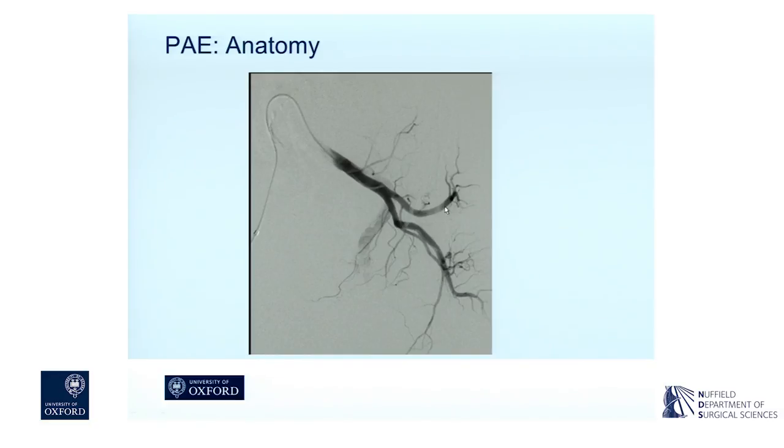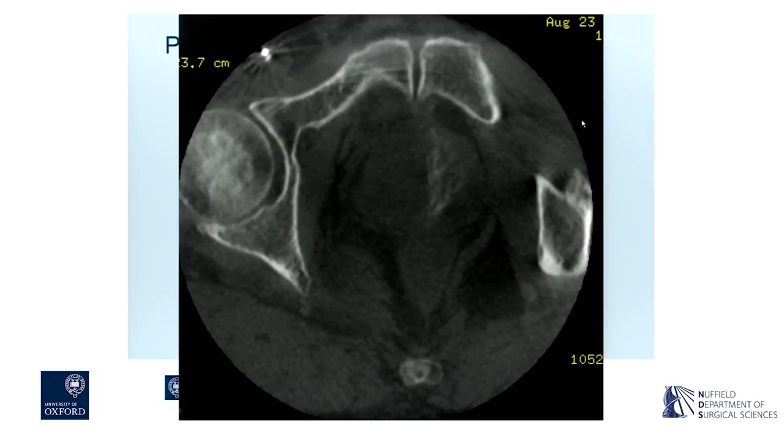So you can see that we need to make sure that we're a decent way down that prostate artery, because otherwise we're going to reflux particles back up and potentially into the superior vesical artery and cause bladder ischemia. So it's really important. And as I mentioned, one of the techniques we employ to try and minimize inadvertent non-target embolization is the on-table Dyna CT or rotational CT.